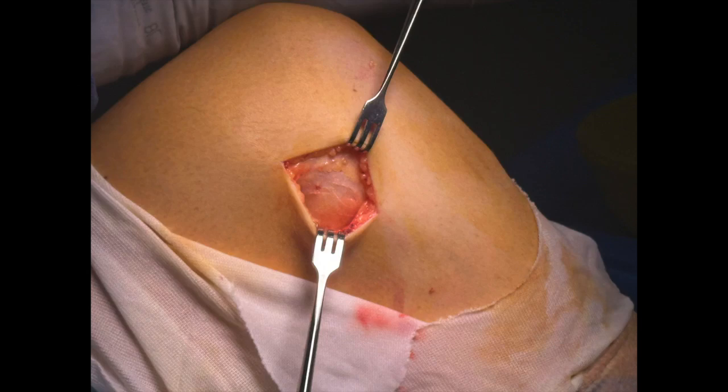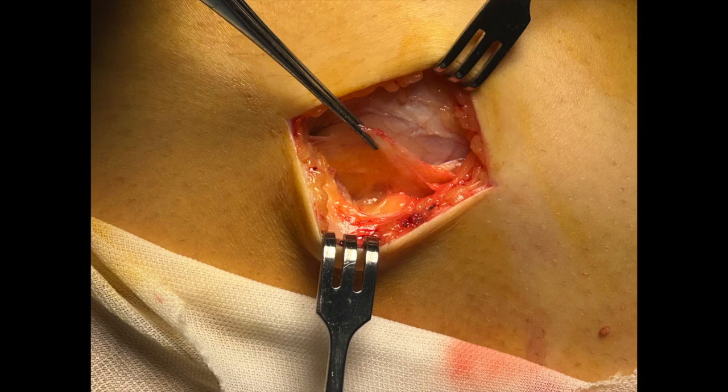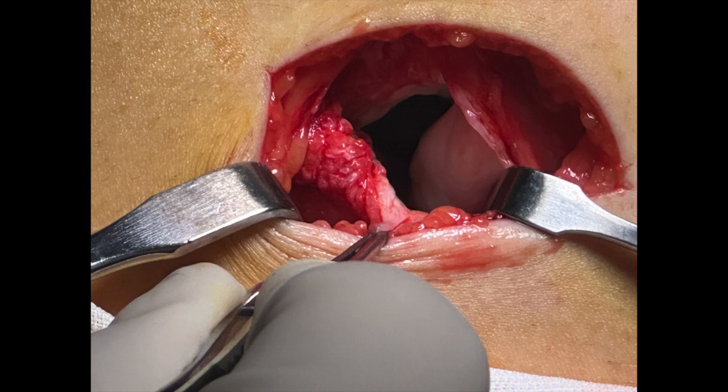Recapping the surgical layers, the retinaculum is exposed and incised obliquely. This layer can then be reflected inferiorly to expose the joint capsule. An L-shaped capsulotomy is performed to expose the peripheral meniscus.